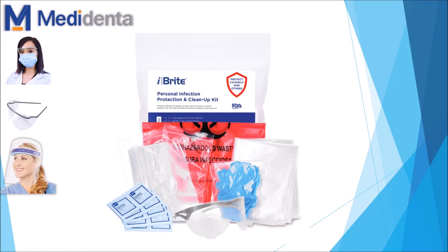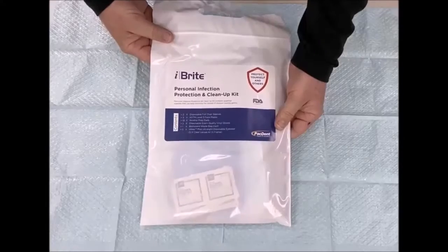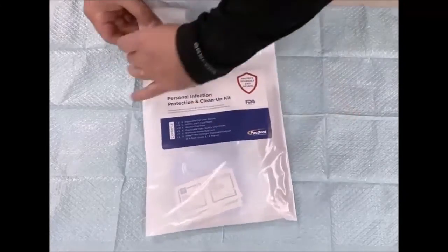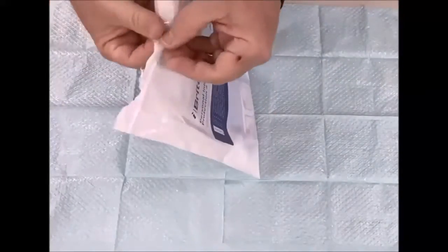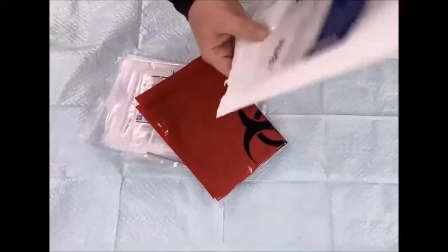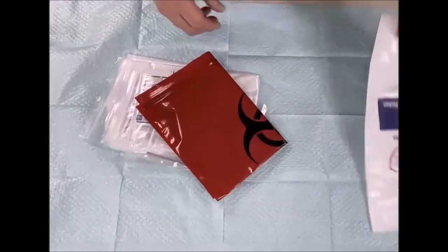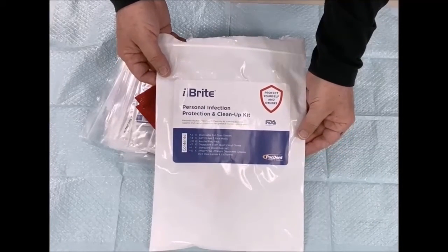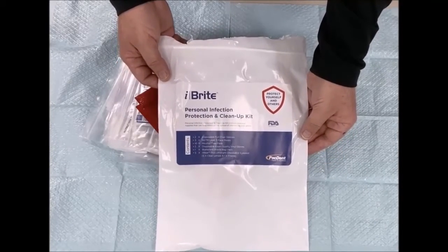Let's see the personal infection protection and clean up kit video. Personal infection protection and clean up kit. So pretty much you just open — let's open the kit. So here you have some very interesting stuff to be used. It's called the personal infection protection clean up kit. We have it here at Medidenta.